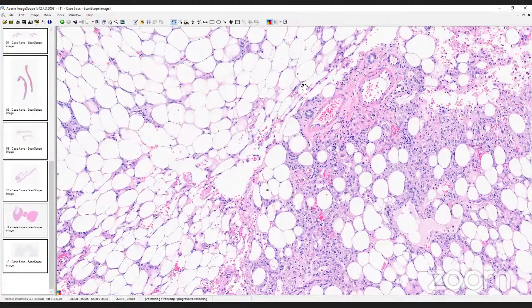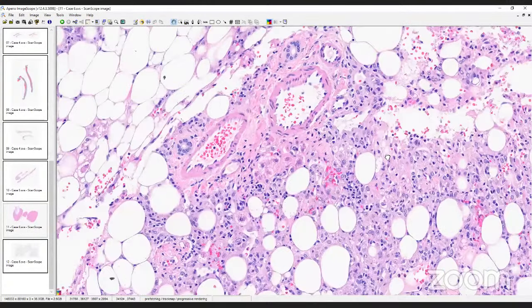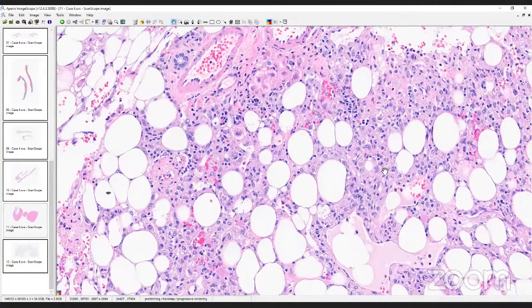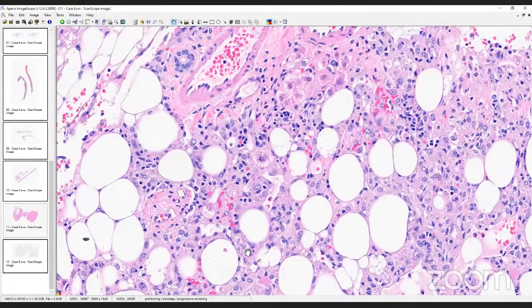There is this structure here, where there are large vessels, but then there are also bile ducts. So I suspect that there is a portal tract over here. But once again, if we look within this area, you see a lot of extramedullary hemopoiesis. And then you see some of these cells that look a little bit epithelioid with a feathery type of cytoplasm, a fibrillar cytoplasm, I should probably say. These are normal hepatocytes that seem to be trapped within the lesion, or they are at the edge of the lesion.